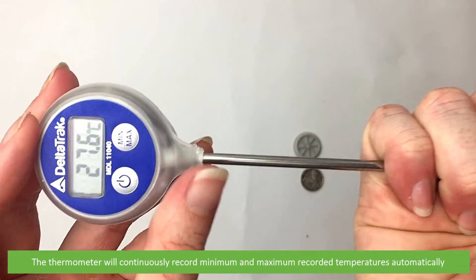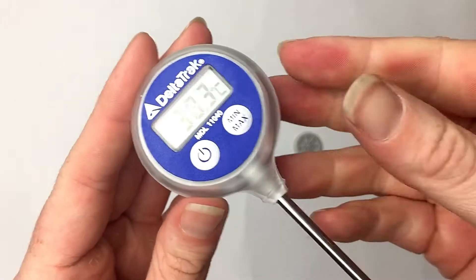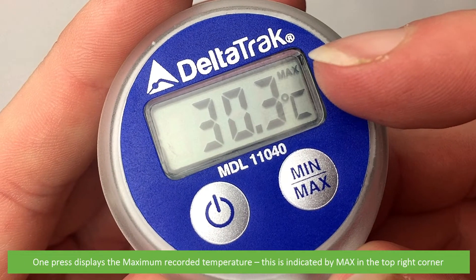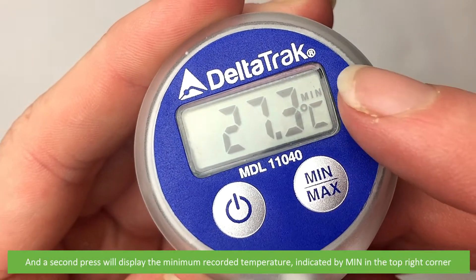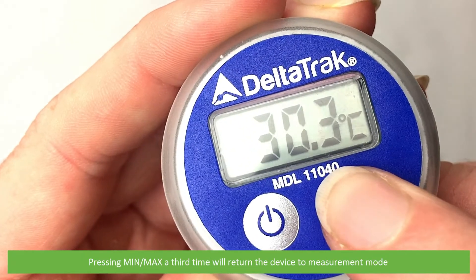The thermometer will continuously record minimum and maximum temperatures automatically. To view the minimum and maximum recorded temperatures, press the min-max button. One press displays the maximum recorded temperature, indicated by 'max' in the top right corner. A second press will display the minimum recorded temperature value, indicated by 'min' in the top right corner. Pressing min-max a third time will return the device to measurement mode.